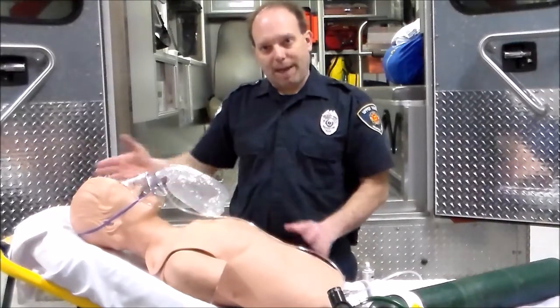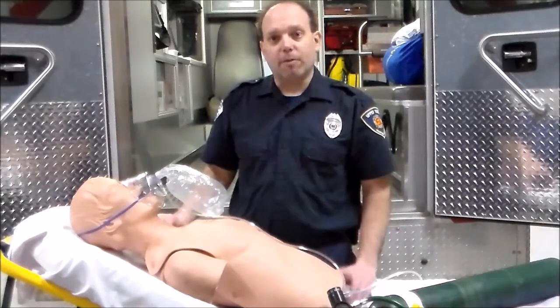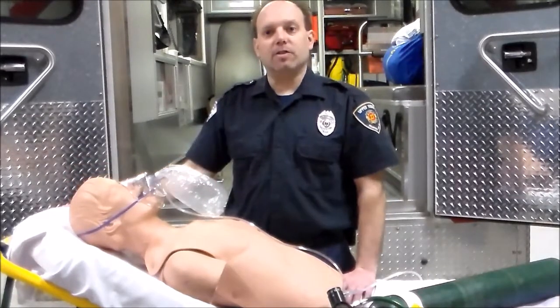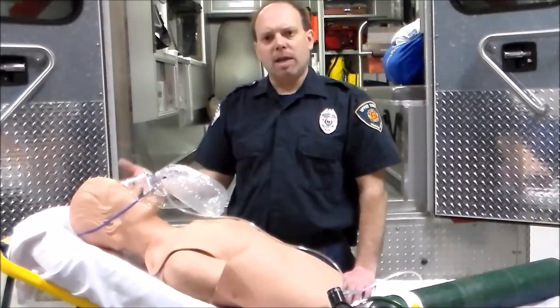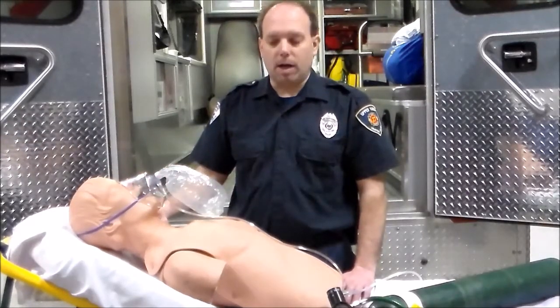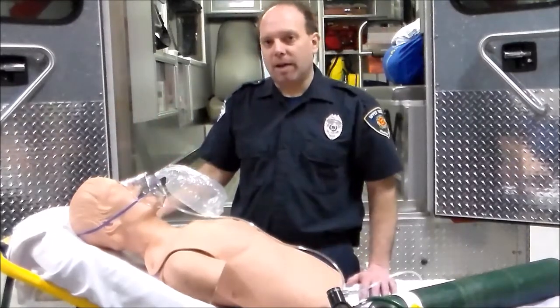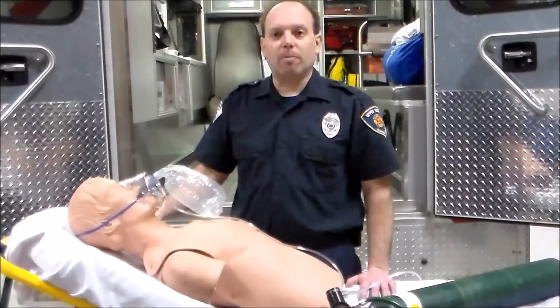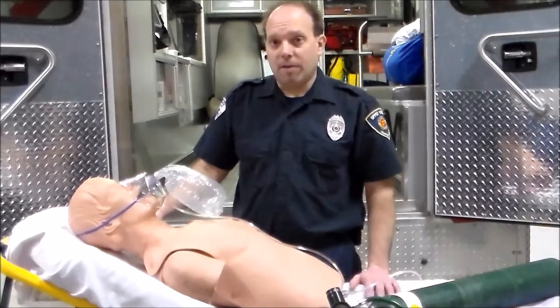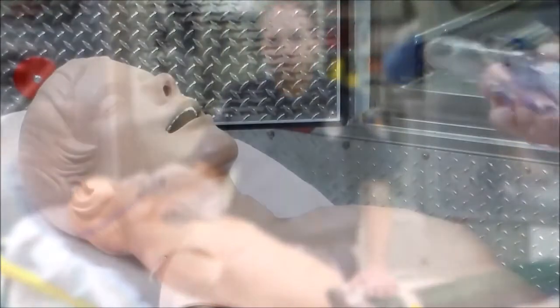You'll also notice that the patient has been sitting up — they're at this angle primarily for the camera, but this is probably one of the best ways to handle airway management as well: having the patient elevated a little bit makes our job easier. Obviously if the patient was awake, you'd want to sit them up a whole lot more to make them more comfortable, and they can tell you whether they're comfortable. Make sure you put them in a good position for comfort.